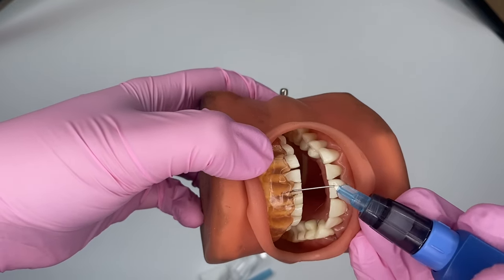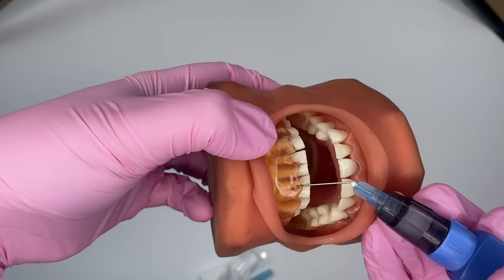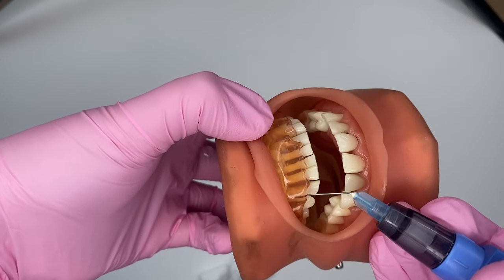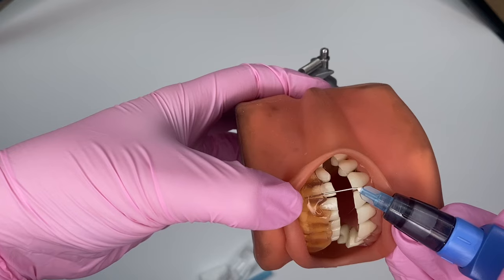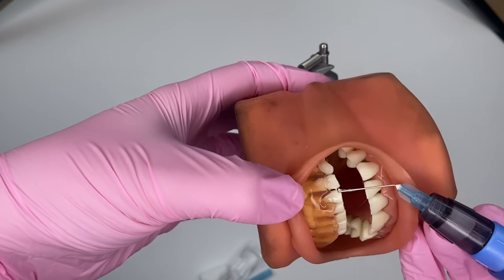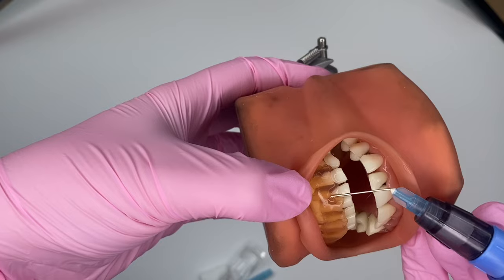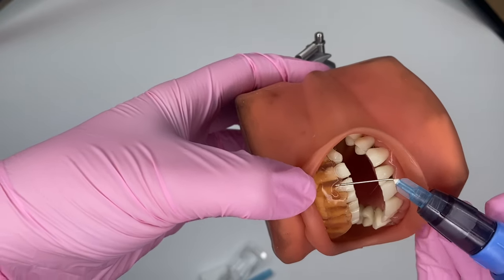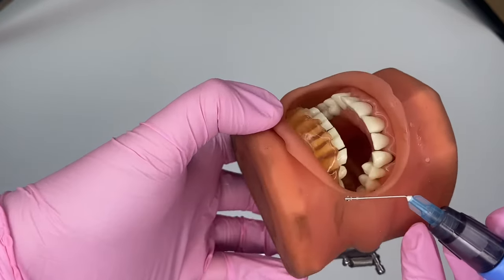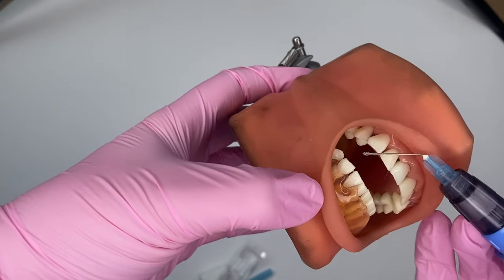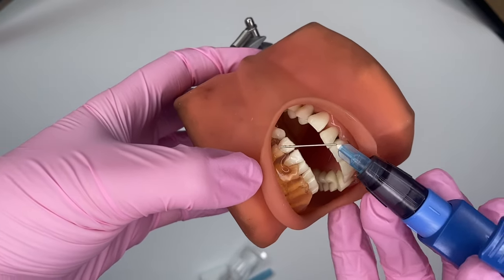This is a topical anesthetic that only lasts up to 20 minutes according to the manufacturer. I think it lasts less, especially if you're using an ultrasonic with lots of water. I recommend placing it on a few teeth or just one quad, then working there before moving on. If I place it on the top and bottom on one side, by the time I switch to the next quad, it's completely worn off.